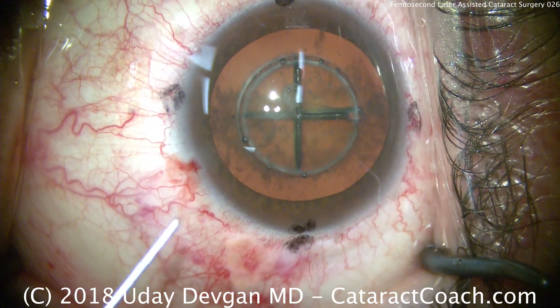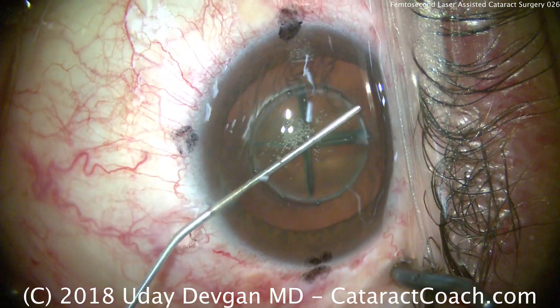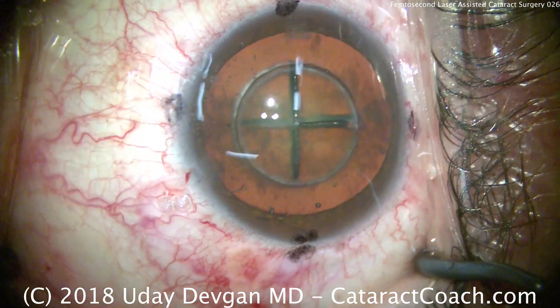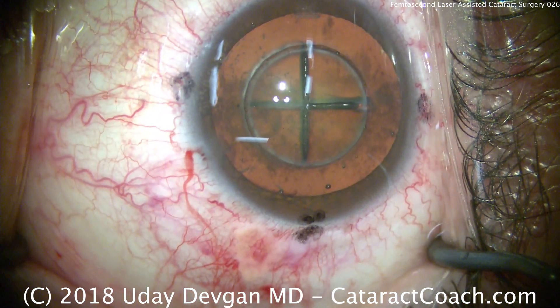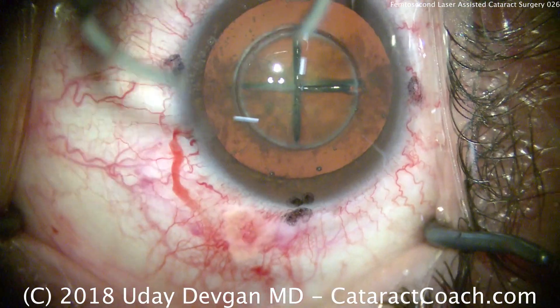I actually prefer to make my main incision with a diamond keratome, which I find does a better job — more predictable with better sealing — than using the femtosecond laser for the incision. The eye is filled with viscoelastic, and here we're going to use that diamond keratome to make our temporal incision.